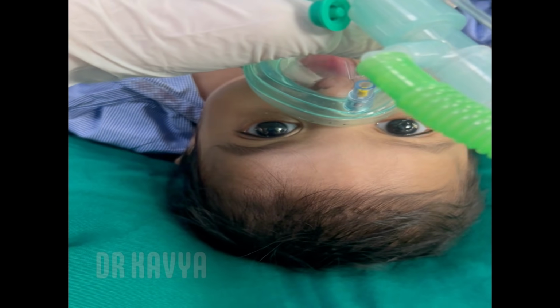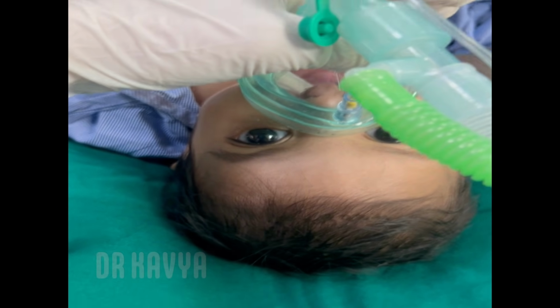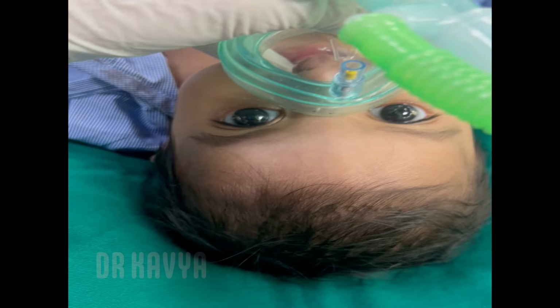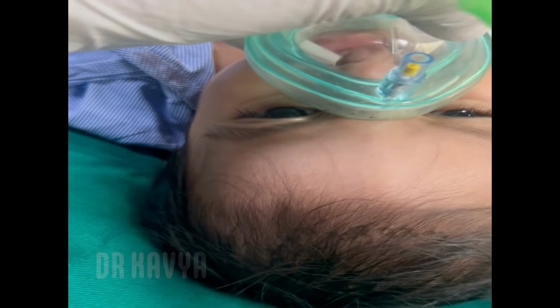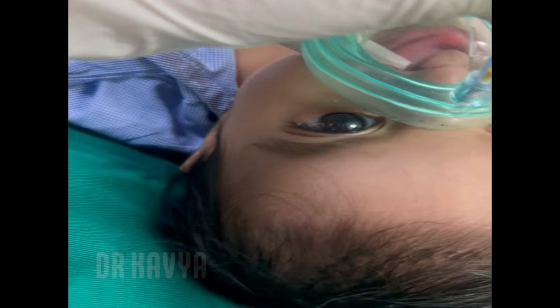In infants less than 6 months, the little finger of your hand is placed in their mouth while you hold the face mask near their face. They generally stop crying and eagerly suckle on your finger and go to sleep calmly.